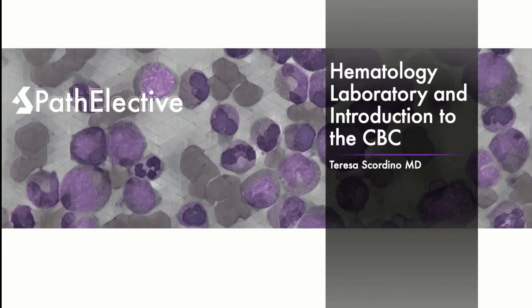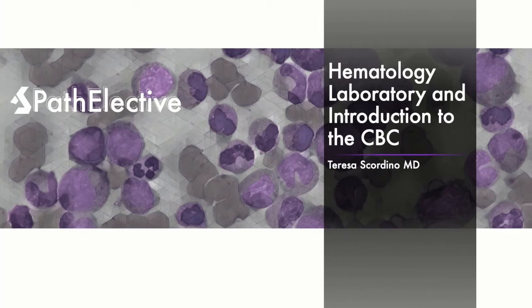In this module, we're going to do a brief tour of the hematology laboratory and learn about how the laboratory performs a complete blood count, which is a commonly used laboratory test.